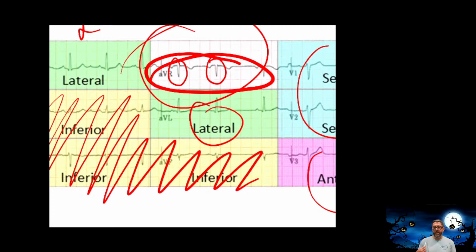When you guys do your lab in a couple weeks, I won't be there unfortunately, so I'm sorry about that. I won't be there for the EKG lab. But you guys are practicing on each other. If you mix up left arm and right arm and you flip them, AVR becomes positive. And that's how you know that they have that issue.